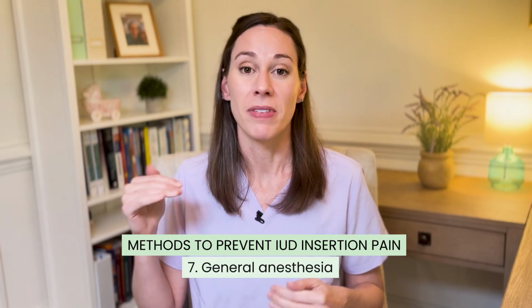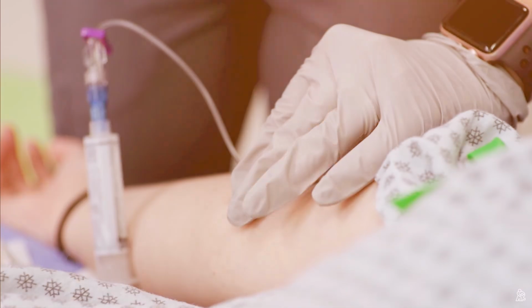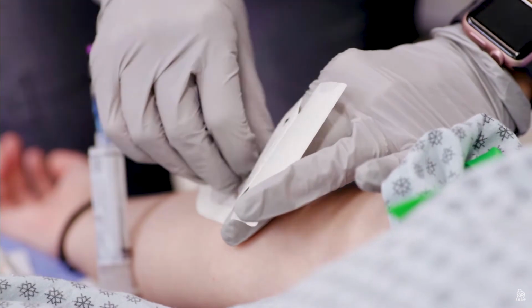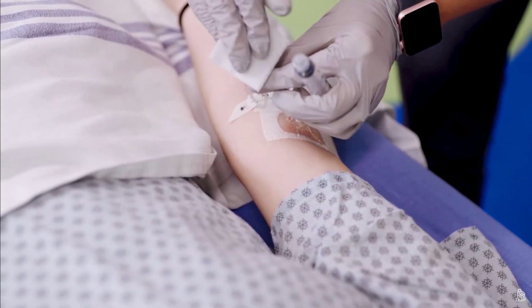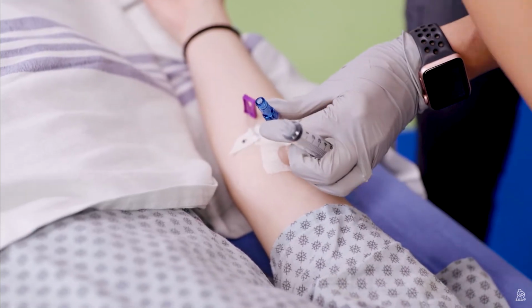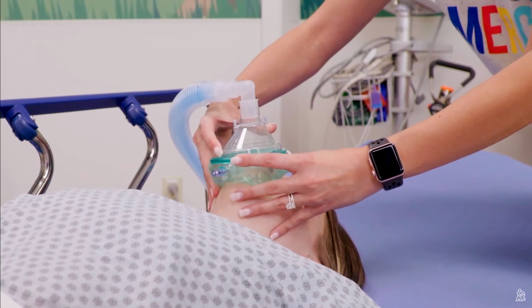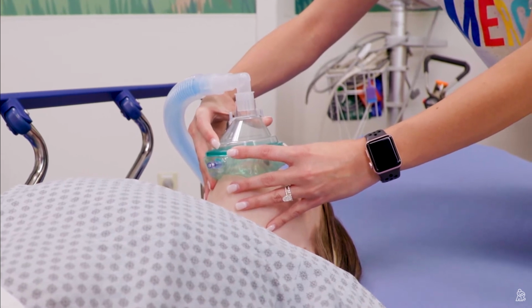And then one step up from that is to actually go under general anesthesia, which is not usually needed for an IUD, but sometimes is done if we're having other procedures done as well. Something that I will often do is someone who, for whatever reason, we are planning to do a D&C or a hysteroscopy, in which case they would go to the OR and be either fully sedated or actually under general anesthesia, would be to go ahead and place an IUD once I'm done with that procedure as well. So these are some options to treat the pain that's associated with an IUD insertion.